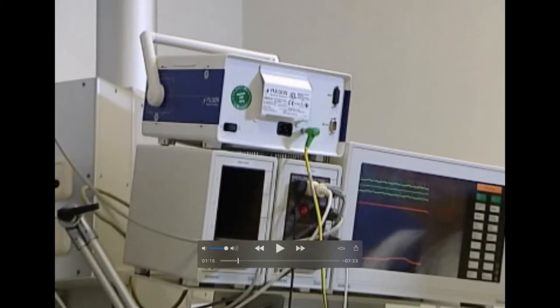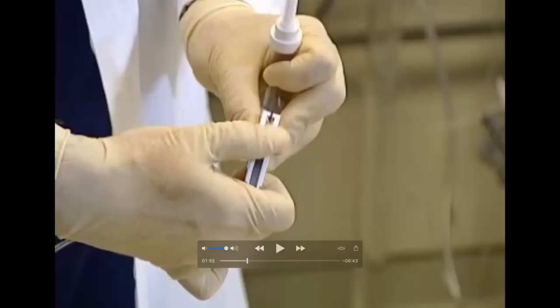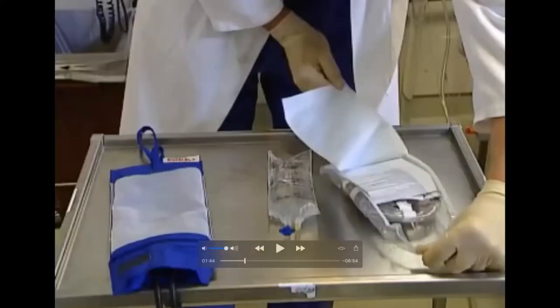So one end should be connected to the transducer and the other end should be connected to the monitor end, right? If they didn't understand it, madam, you can play it again. Did everybody get it or are there any doubts? Everyone clear on it? Is it here all right? How much do you want to skip? That is the how to... That part you can use the transducer, right?